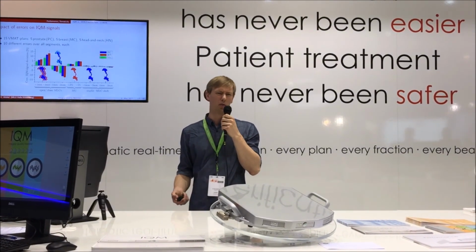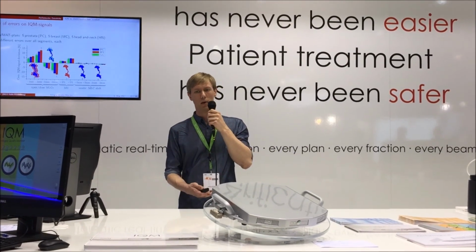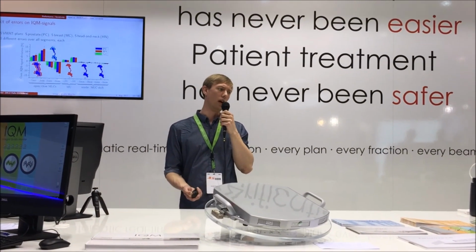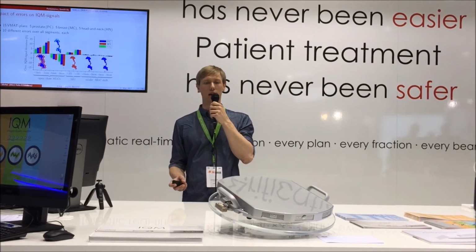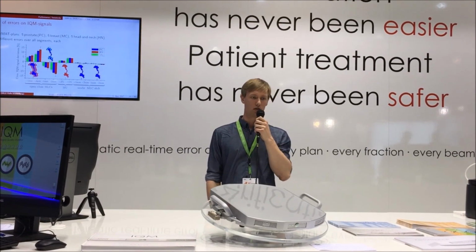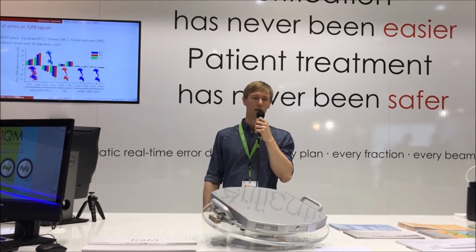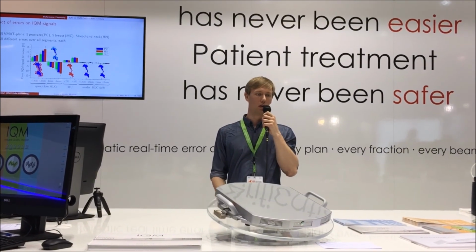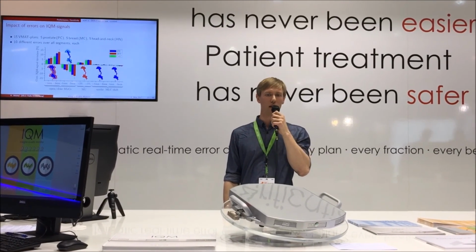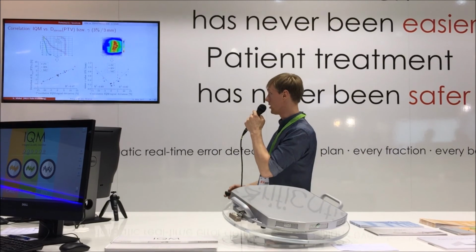So now we have to think about how clinically relevant those errors that we introduced really are. So how much impact do the errors have in the patient? To answer that question, we can either have a look at the dose volume histograms and calculate deviations from there, or we can have a look at two-dimensional dose distributions that we calculate from all of those 165 plans and simulate our gold standard QA tool of the two-dimensional ionization chamber array within the Octavius phantom by doing that, and to calculate gamma values from that. No sooner said than done.